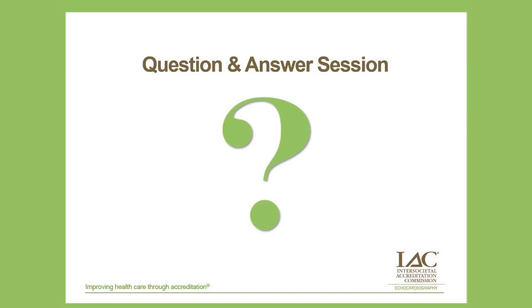Okay, Andrew wants to know, do you incorporate cardiac MRI into your workup? If so, when do you use it? So it's in the new guidelines that came out last year for assessing valvular regurgitation. We put that in there, and the when becomes more of a clinical decision. But oftentimes it's hard to say for sure whether it's moderate or severe MR, and that's a critical decision point because if it's moderate, you're not going to do anything, and if it's severe, you may need to do surgery. So when you're uncertain about that, an MRI is going to be the referee that makes the decision.